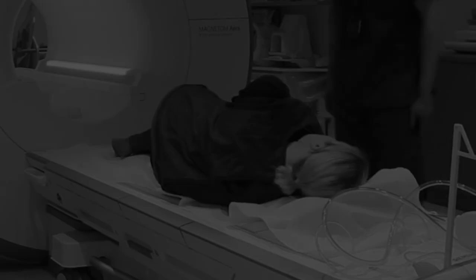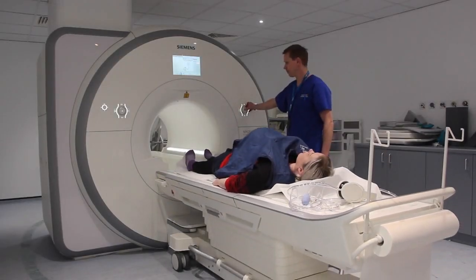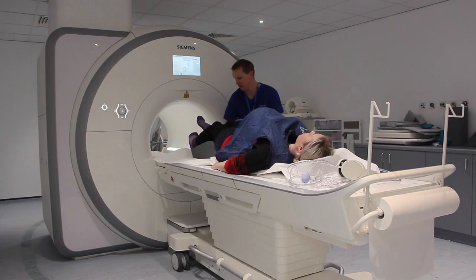In this case, a semi-decubitus position is chosen. Ask the patient to lie on the table in a comfortable position, feet towards the magnet. There is no need to place the patient in the magnet head first, as this can increase their feeling of claustrophobia.